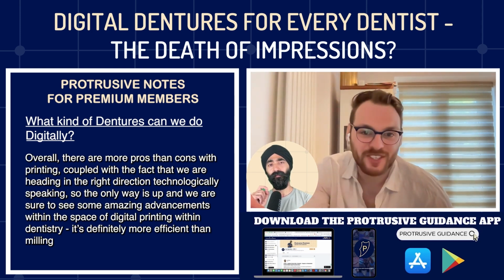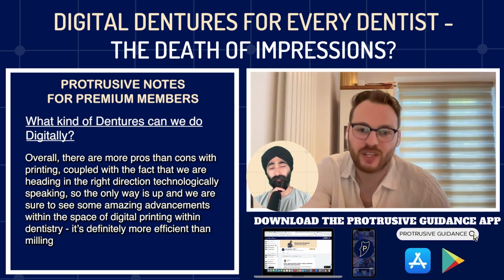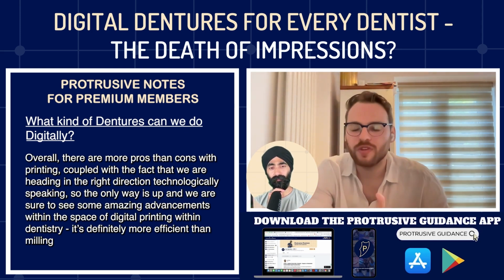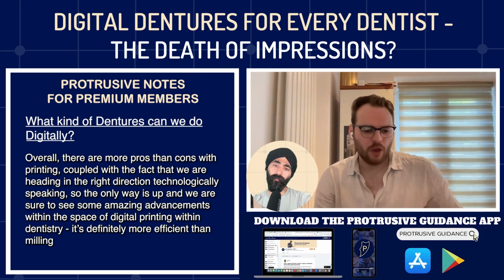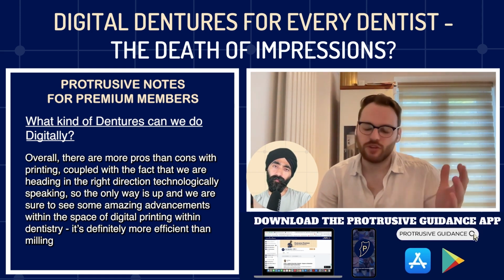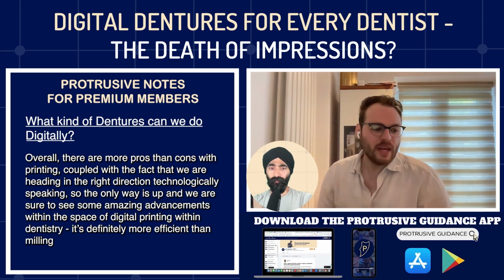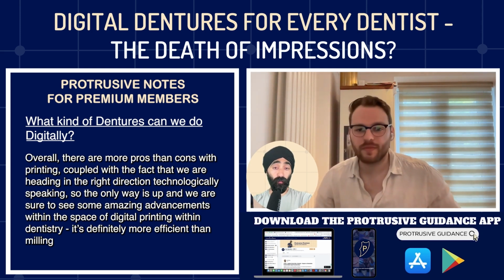It's just, the same as anything. Additive manufacture is always going to be the future because it's faster. There's less waste involved and so forth. So that sort of manufacture side of it, I say it's just one caveat. It's a lot more accurate and we'll touch on some cases that I've been doing perhaps, but it's a lot faster, more efficient for the technicians as well. So printing's more efficient, yeah?